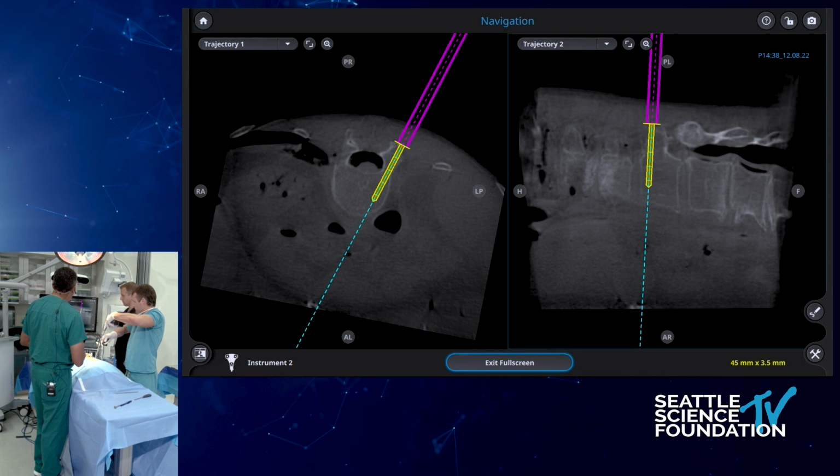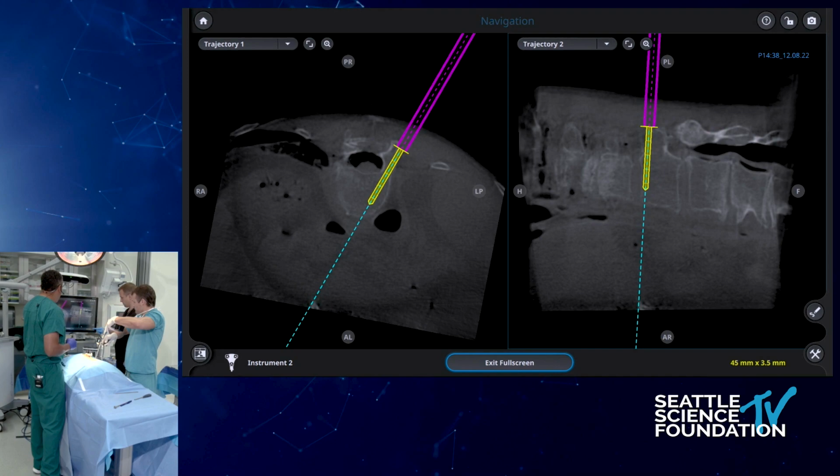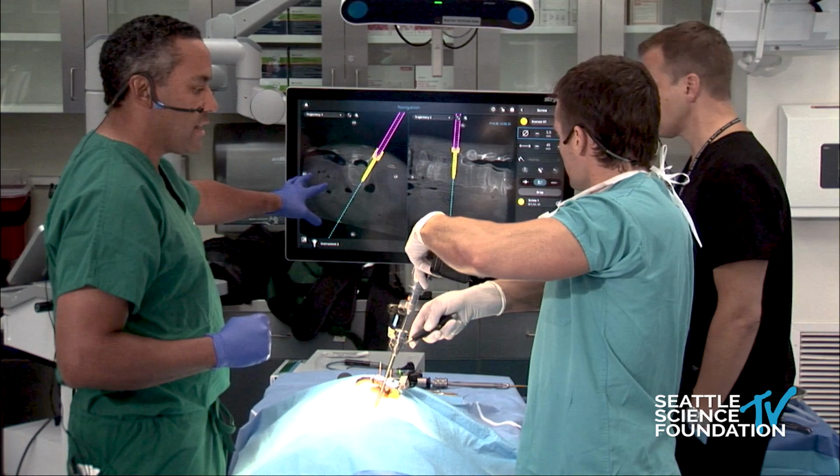Just a little bit more. Okay, so that's a great trajectory, and then aim just a little bit more medial, and then just get this thing going. Okay, now you've buried this thing, so now he's going to drop a screw, and we said a 5.5/45 is just what we had loaded up. So he's going to drop that screw. That tells you that's where our screw is going to end up. Okay, so now pull this out. Now take the screw.